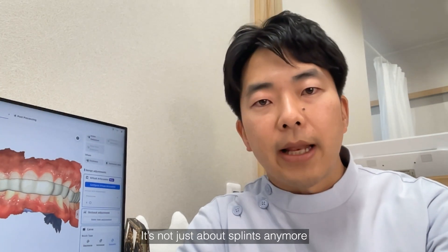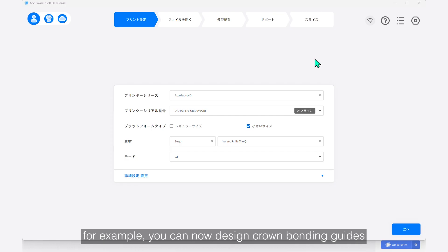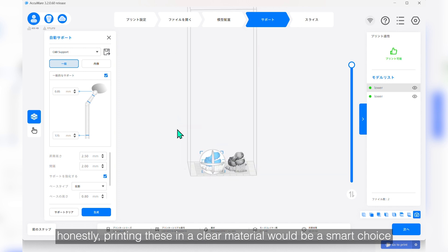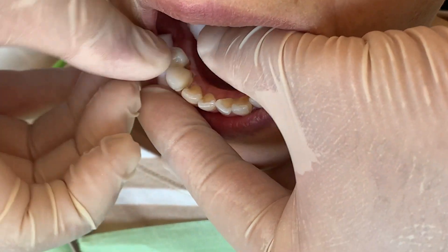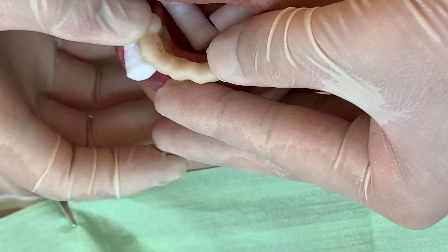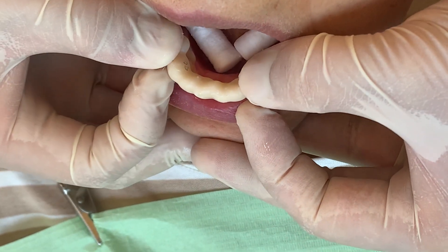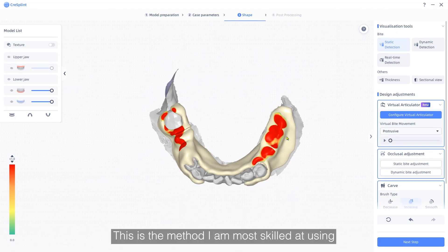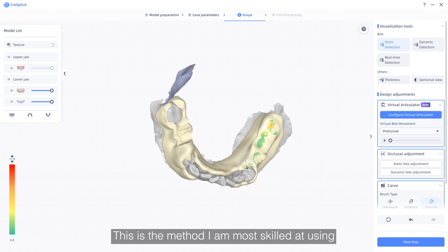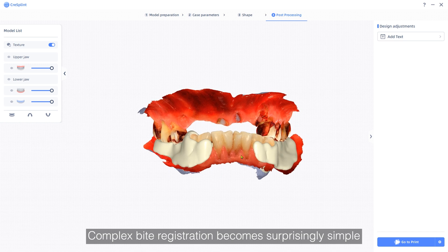It's not just about splints anymore. For example, you can now design crown bonding guides — honestly, printing these in clear material would be a smart choice. And custom occlusal rims; this is a method I'm more skilled at using. Complex bite registration becomes surprisingly simple.